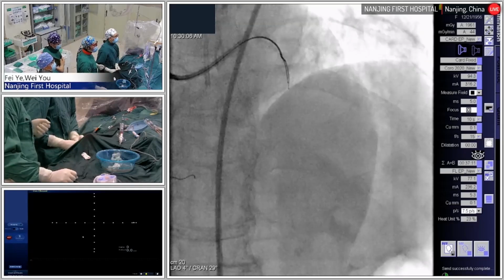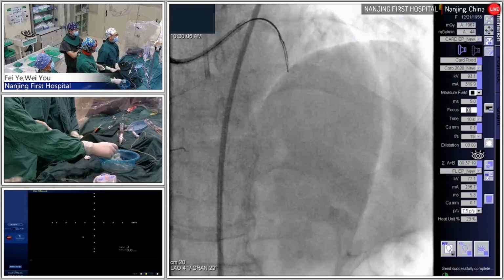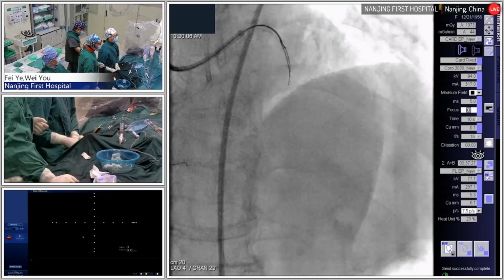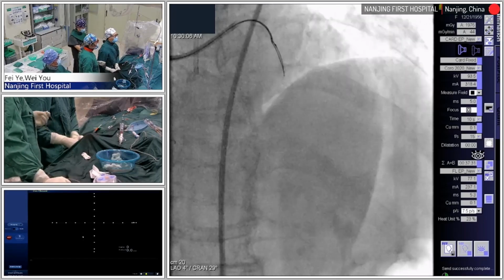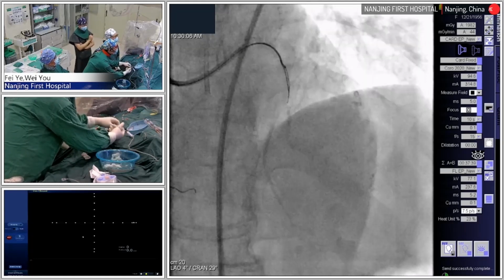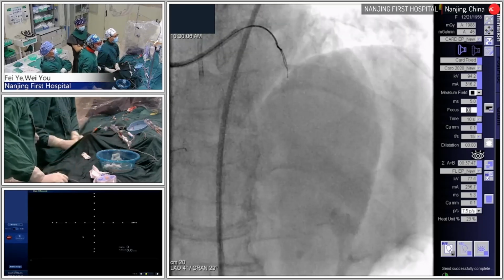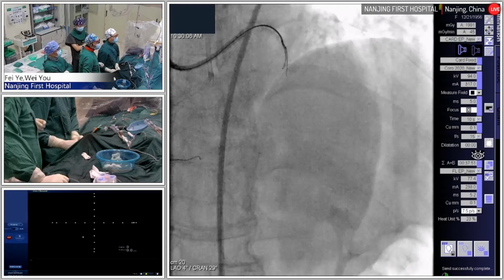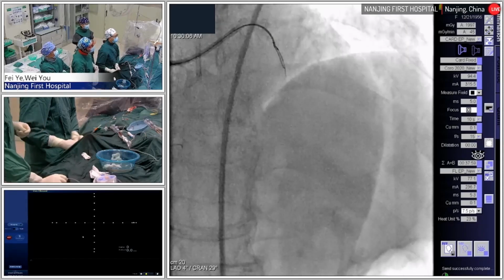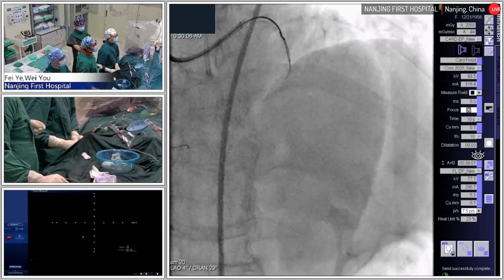So there is another question. Would IVUS help here? I don't think IVUS can follow. Maybe IVUS guided the antegrade. Maybe that is the last choice according to my experience. In the previous procedure of this case, even a double channel microcatheter could not be pushed into the distal to the middle LAD, just because the lesion was very tough. I think IVUS cannot go through, because the profile of IVUS is larger compared with the double channel microcatheter. So I don't think we can get the benefit from IVUS here. We cannot see the entry point from the IVUS guidance in this kind of situation.